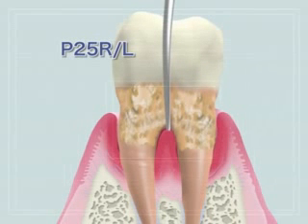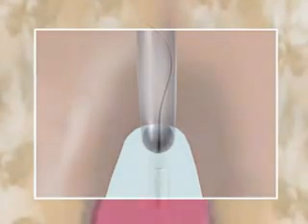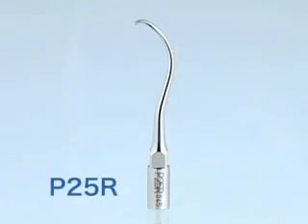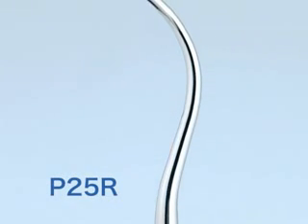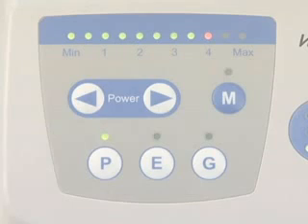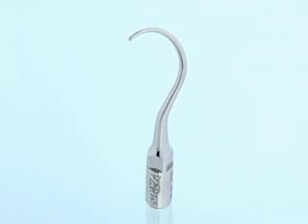Varius 750 tips P25R and P25L are very effective in a case like this. For these very thin tips, power is set at P mode minimum to 4. High power can be dangerous and should be avoided, as it may cause fracture of the tip.